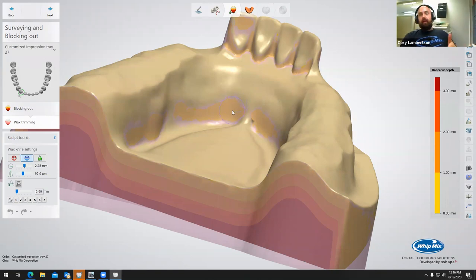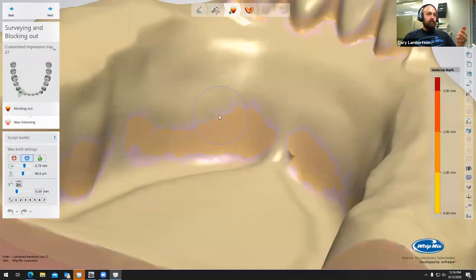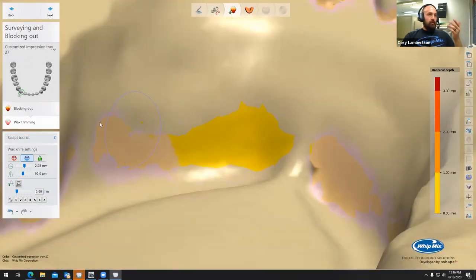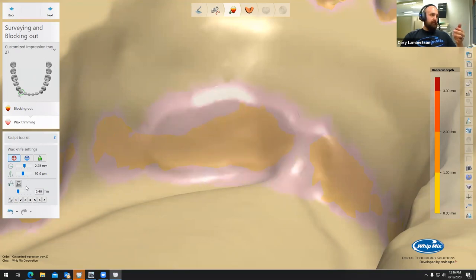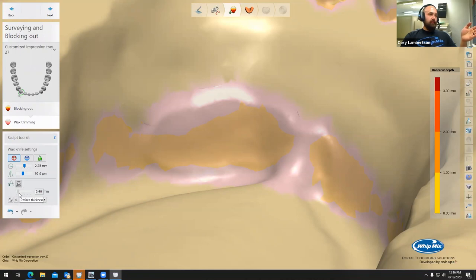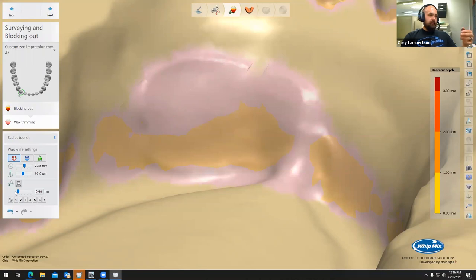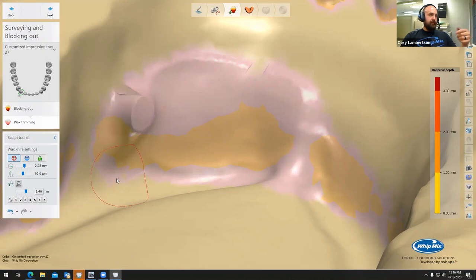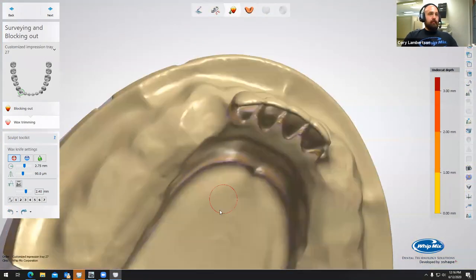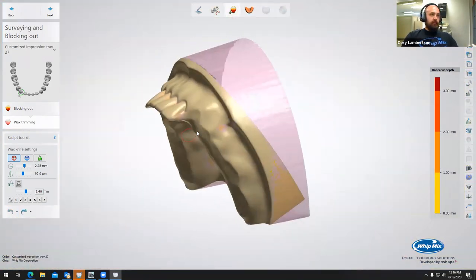We'll go ahead and apply, then select next, and the software is going to automatically render the blockout wax to block out any undercuts according to the path of insertion that we dictated. The software is smarter than me — it has an algorithm that's way smarter than what I am. We're going to let the algorithm dictate where the blockout wax needs to be. You do have the ability to take it away or add it manually. There is also a value setting on the left-hand side depending on how far you want it to go for your desired thickness.